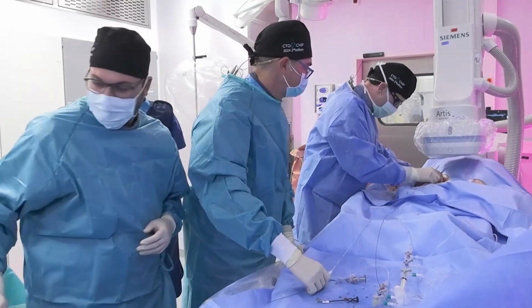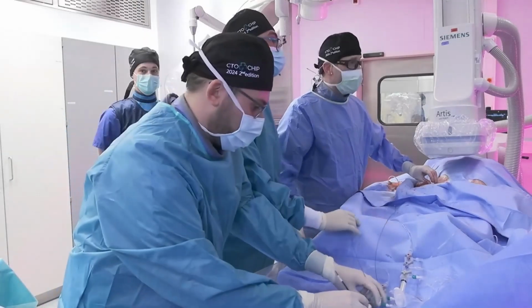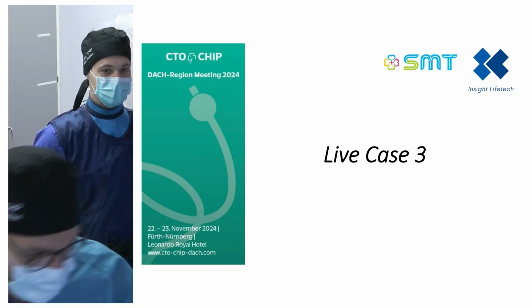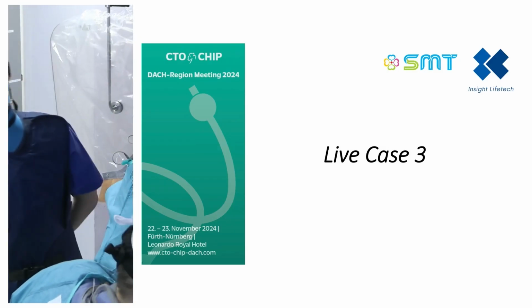Felix, maybe you can show us the case presentation. I'm going to give it to Christoph. Perfect, thank you. We're going to prep a little further. So, hello again from my side. Michele, I need the slides.